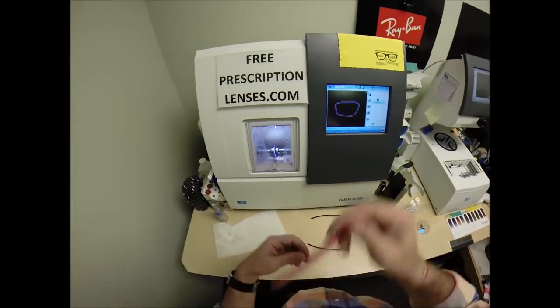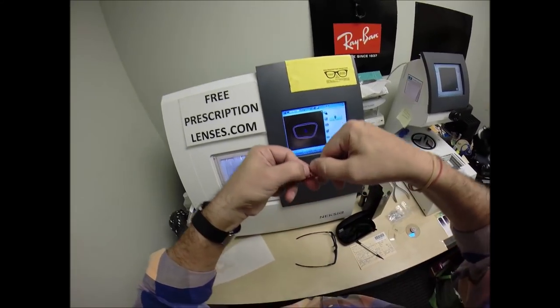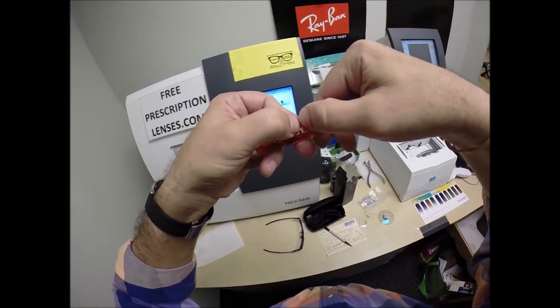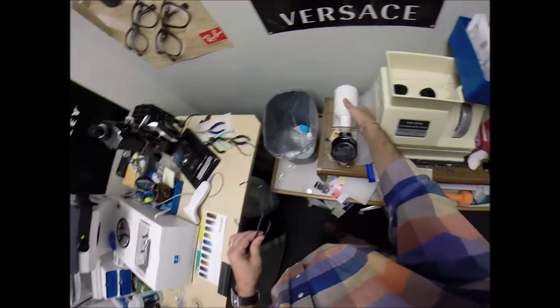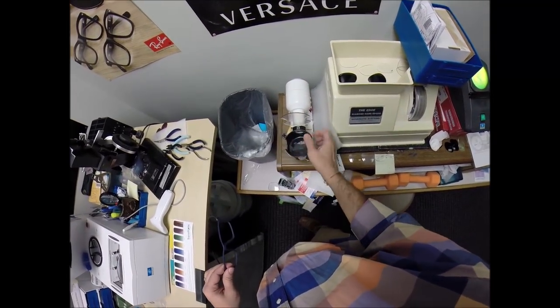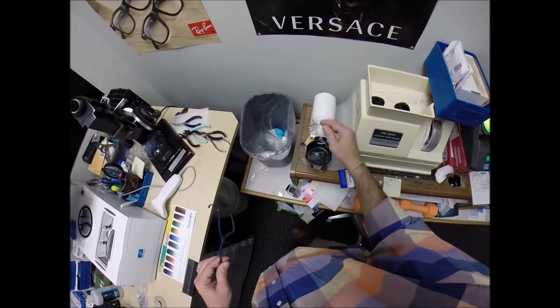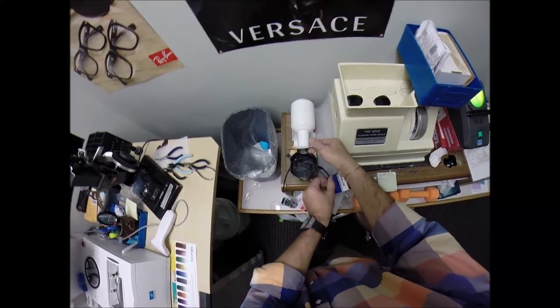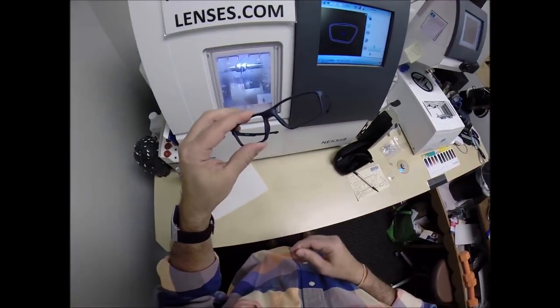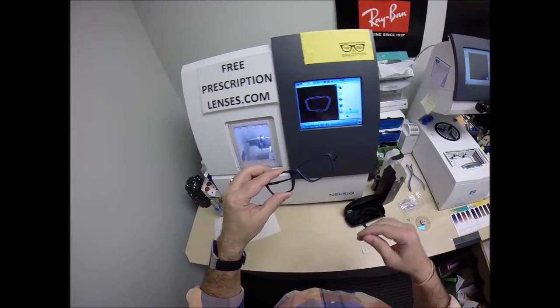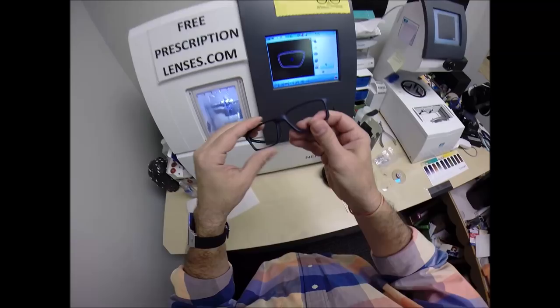You can always cut more off of a lens. You can never add it back on. I started a little large and worked my way down. One way to cheat is to apply heat to the frame. This is a $300 hair dryer. It makes plastic more pliable. I do not want to force the lens into your frame.